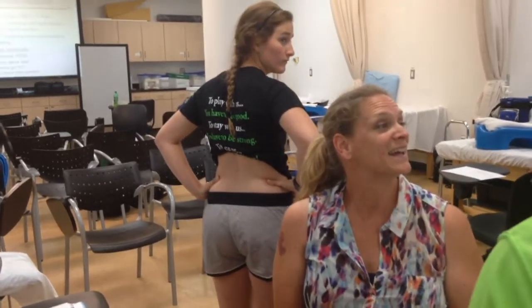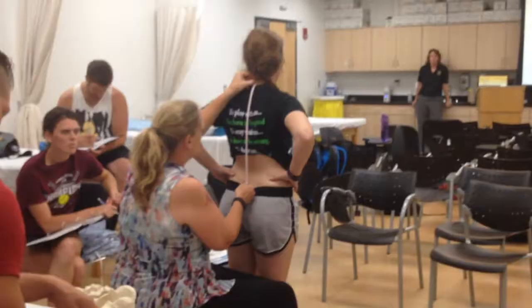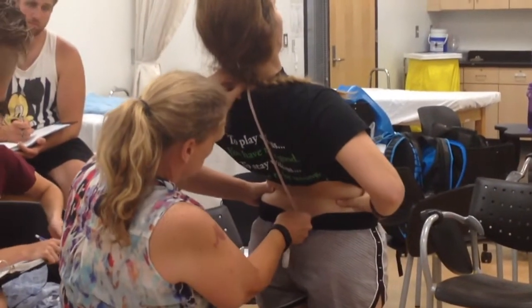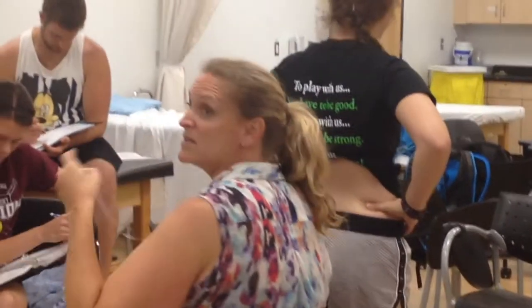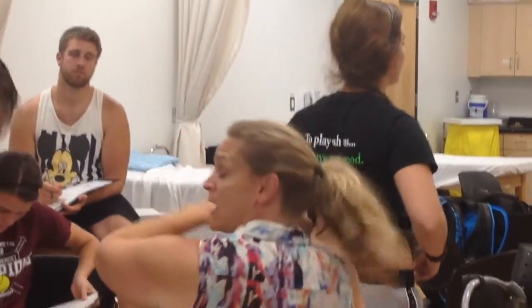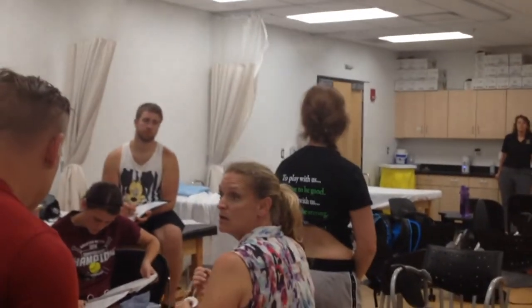Question — do you put the tape against your skin? Nope, it always hangs loose. Arch your back back. So she was at 42.4 centimeters when she extended. So I would then subtract her standing-up position from her extended position to get her extension measurement.